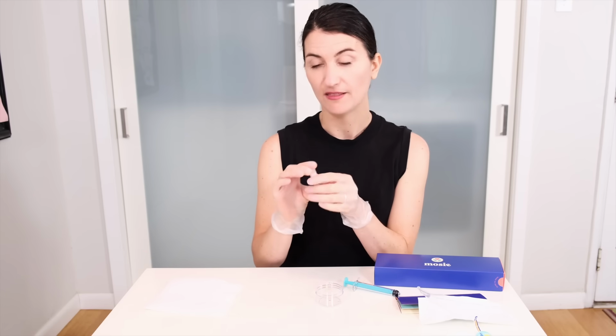Now, as you may have seen, this is ICI in some of our shots. You can order what's called ICI, so that's intracervical insemination vials, or you can order IUI vials. IUI vials are a different amount of semen in the vial. So the ICI has a little bit more. The IUI ones are used typically in a doctor's office, but people have used them at home and they've done them with success. Some people like to order 2 IUI vials for an insemination. We know it's not right for everybody. Do what's right for you. IUI vials tend to have more sperm in them per count, so look at your sperm bank, talk to them, see what you can afford, see what's right for you.